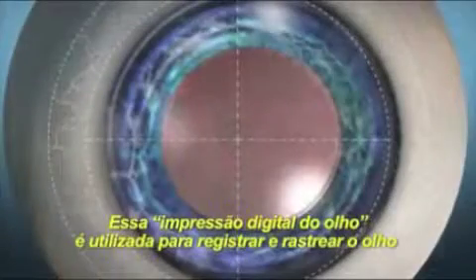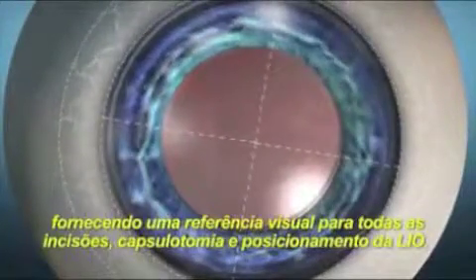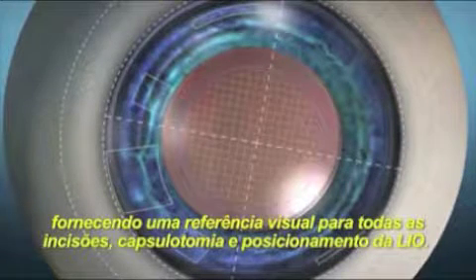This fingerprint of the eye is used to register and track the eye as a visual reference of all incisions, capsulotomy, and IOL positioning.